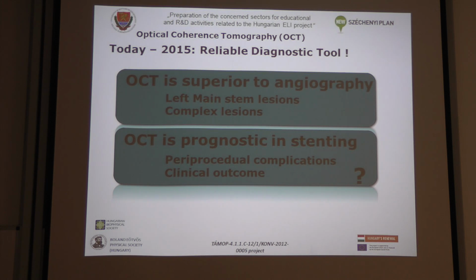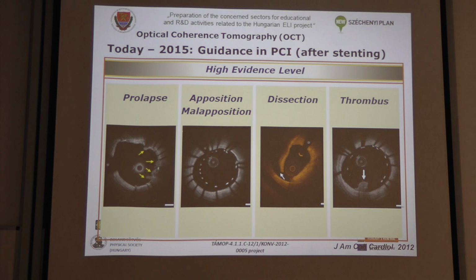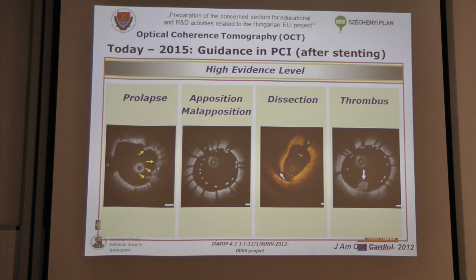So stenting, that is the other very important area where we don't know how useful it is going to be, but this particular, let's say, alteration right after stenting, sometimes it can be really hidden. It sometimes can remain undetected on angiography.